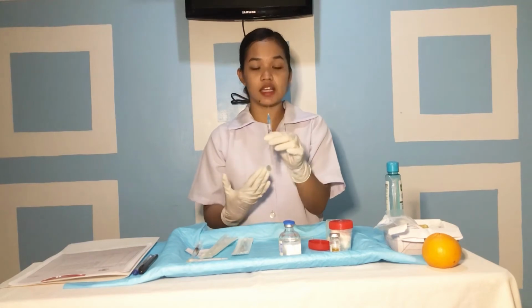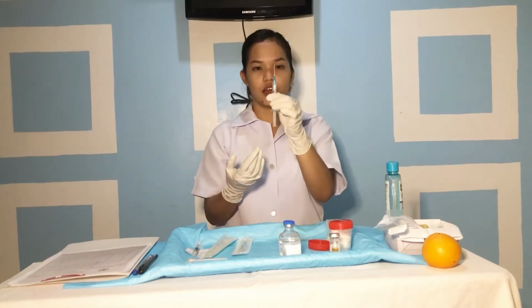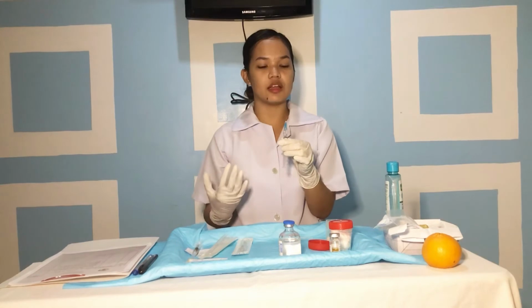If the syringe contains excess fluid, use a sink. We hold the syringe vertically with the needle tip up and slanted slightly toward the sink. Slowly eject the excess fluid into the sink. Then recheck the fluid level in the syringe by holding it vertically. This position of the needle allows the medication to be expelled without flowing down the needle shaft. Rechecking the fluid level ensures the proper dose.